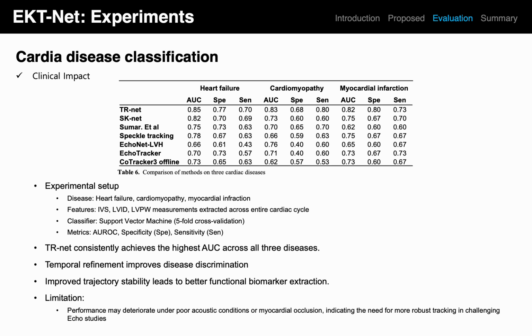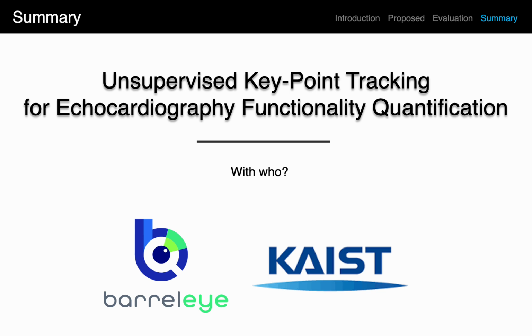However, performance may be degraded under poor acoustic conditions or myocardial occlusion, highlighting the need for more robust tracking in challenging clinical cases. We anticipate that this neural network can support cardiac function assessment in point-of-care settings where ultrasound image quality may not always be optimal.